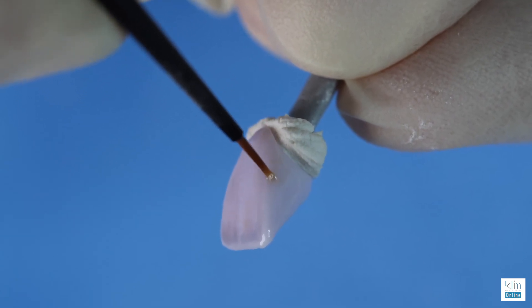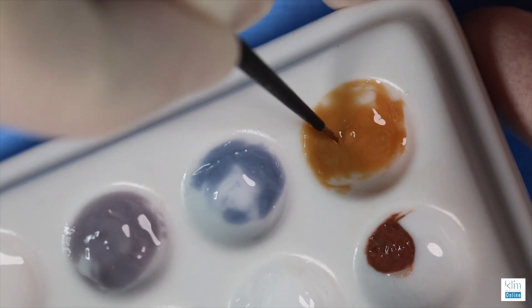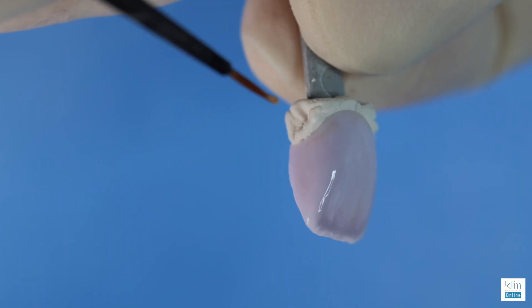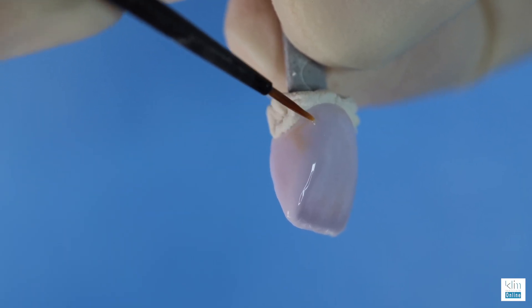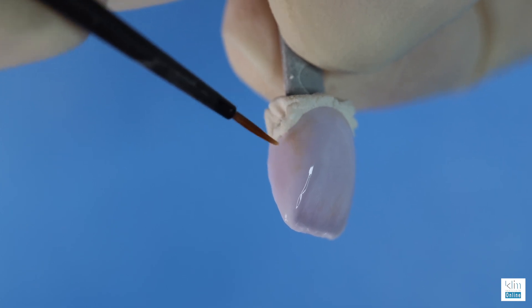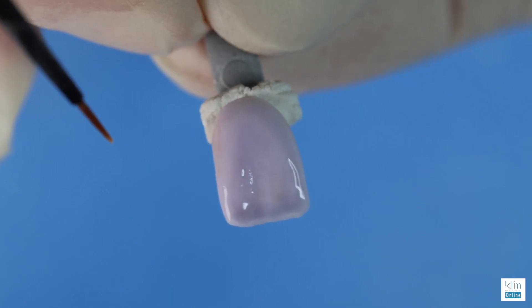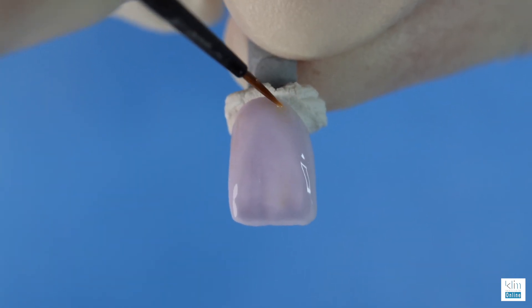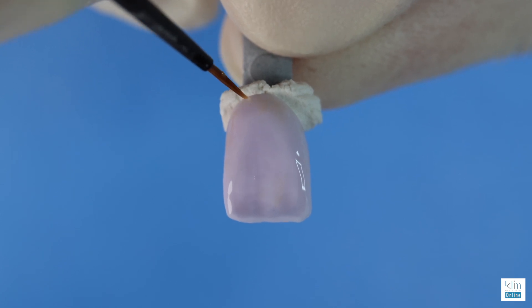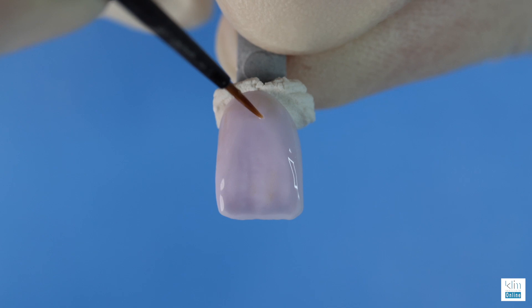Be careful on bleach shades with this approach. We'll add the color cervically up to the contact zone — keep it distal or mesial to the line angle. In many cases I don't add a lot of cervical shade unless I'm having a custom blend in one or two ceramics. You will find by floating the dentinal shade just at that margin and feathering it into the mid-body, it will look very natural and it doesn't blotch.